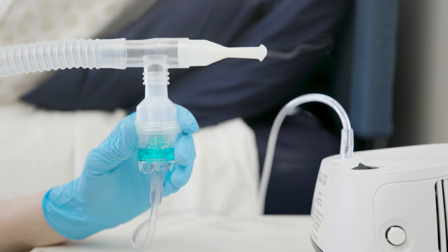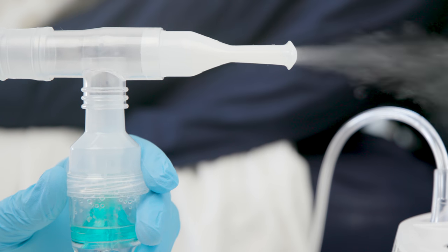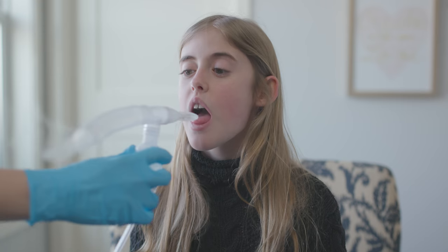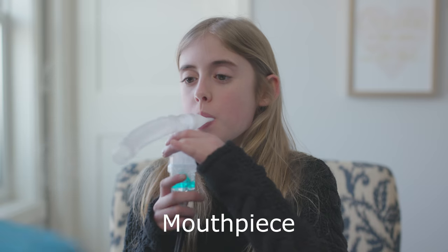Turn on the neb machine. You should see a fine mist coming from the delivery device. If there is mist coming from the delivery device, place the device on the patient and begin the neb treatment.